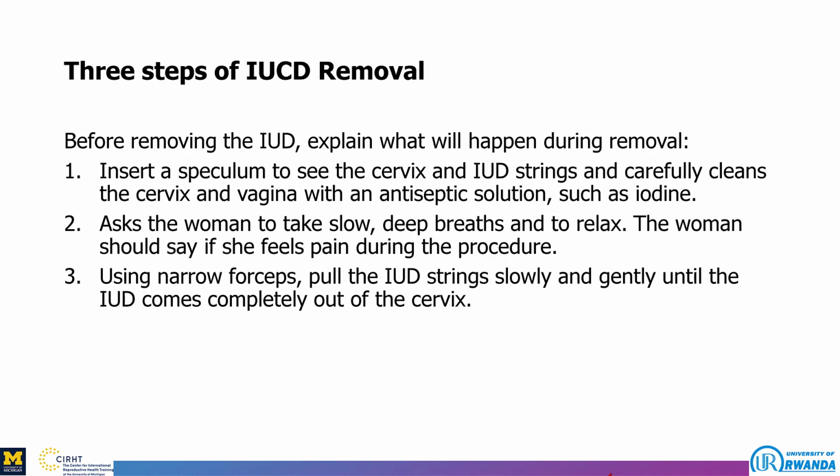We have three major steps of intrauterine contraceptive device removal. Before removing the intrauterine contraceptive device, explain what will happen during the removal to the client. Help her to understand even what she will feel. If there is anything she is supposed to feel, you have to make her understand properly.